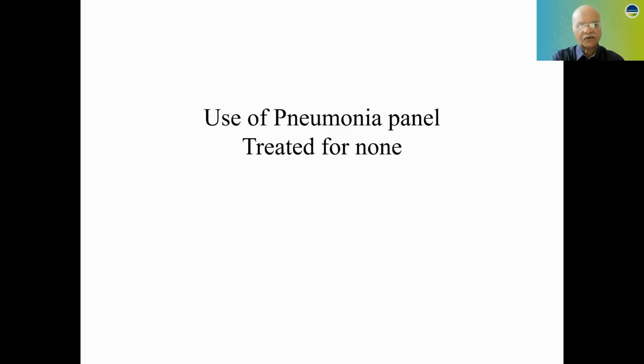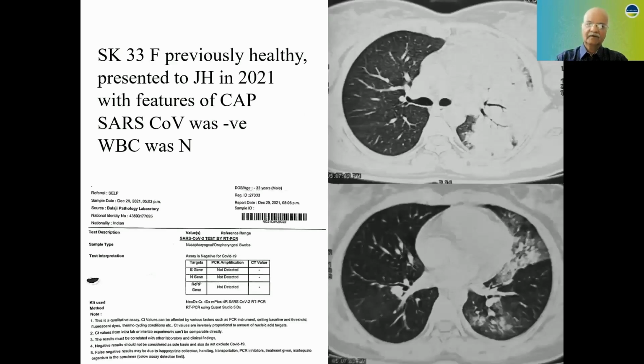And this case, this is the third one, which says that we used the pneumonia panel and actually treated none of them which were detected. So this was a somewhat old case. This was a 33-year-old previously healthy lady. She presented to us in 2021.